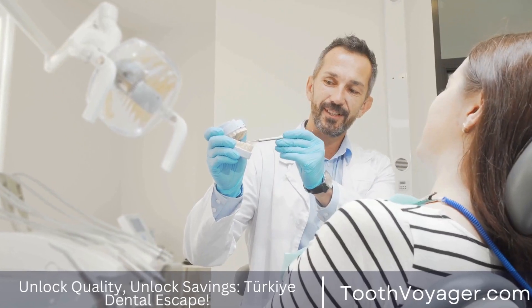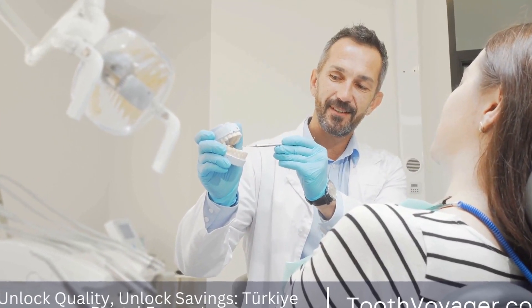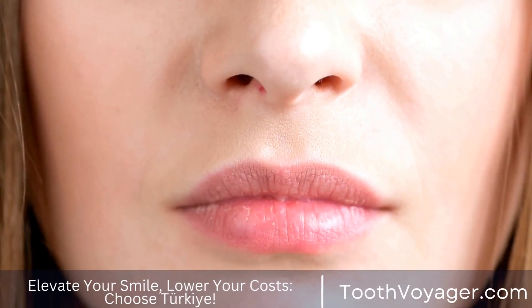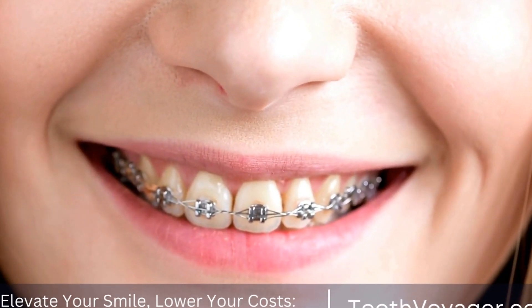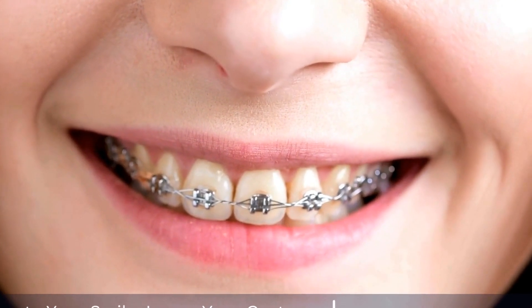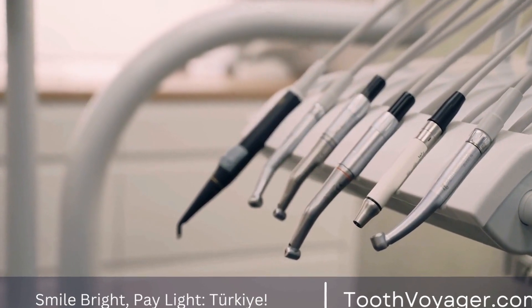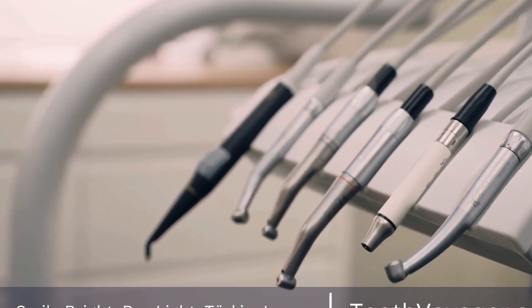Regular dental checkups and cleanings are essential for maintaining the health of the teeth and gums, as well as the longevity of the veneers. The creation of dental veneers is a multi-step process that requires careful planning, craftsmanship, and collaboration between the patient, dentist, and dental laboratory. By following these steps, patients can achieve a stunning smile that boosts their confidence and overall well-being.